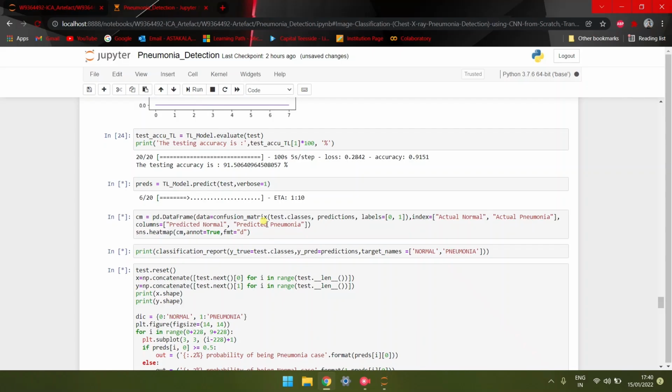The time-consuming process in this entire project is training our model by performing epochs. In each model, it might take around 1 hour to 1 hour 45 minutes to complete the training process. So I skipped the training process, I mean the epoch iterations, in each model. The rest everything is clearly stated in this video.